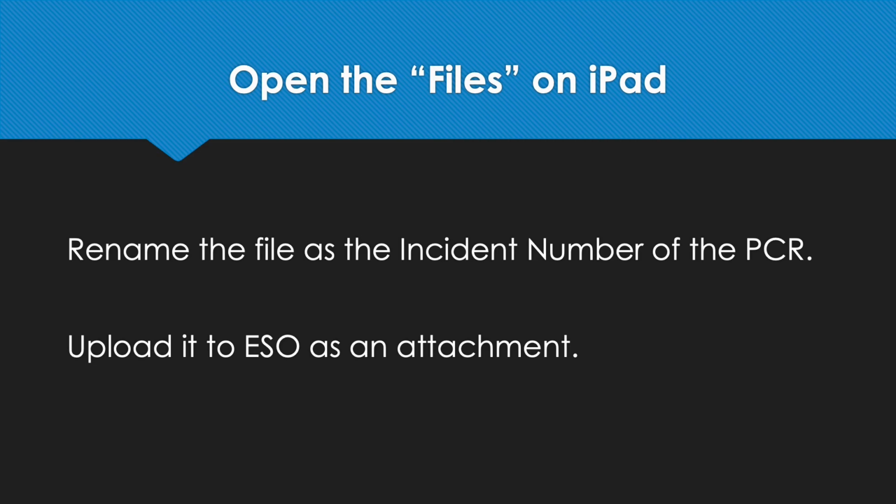Some of the ER docs will be able to see that, but they may not get to see the actual scan, so we may have to give them a login access, maybe an ER access to this so that they can view the video, or you can always show them when you get there on your own iPad so that they can see what you were looking at.